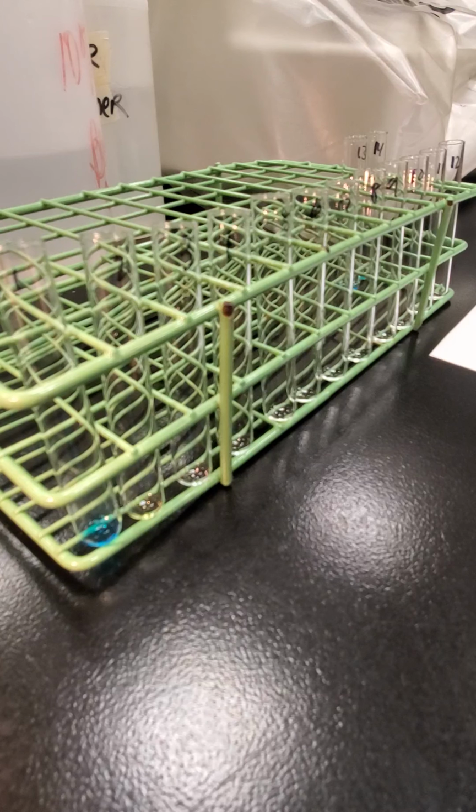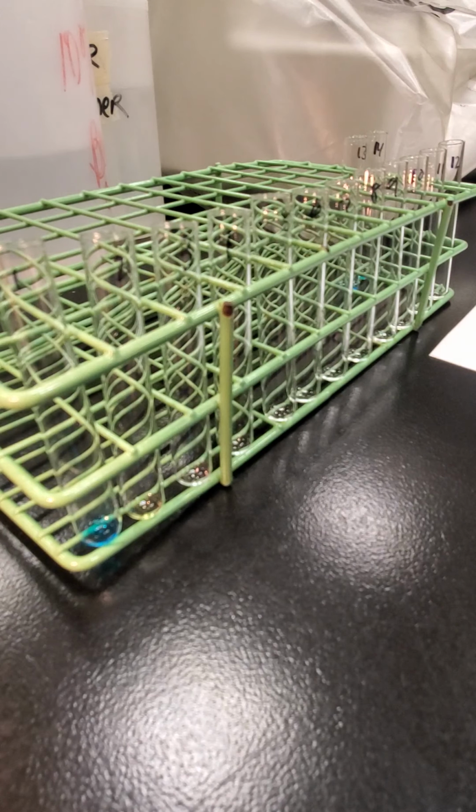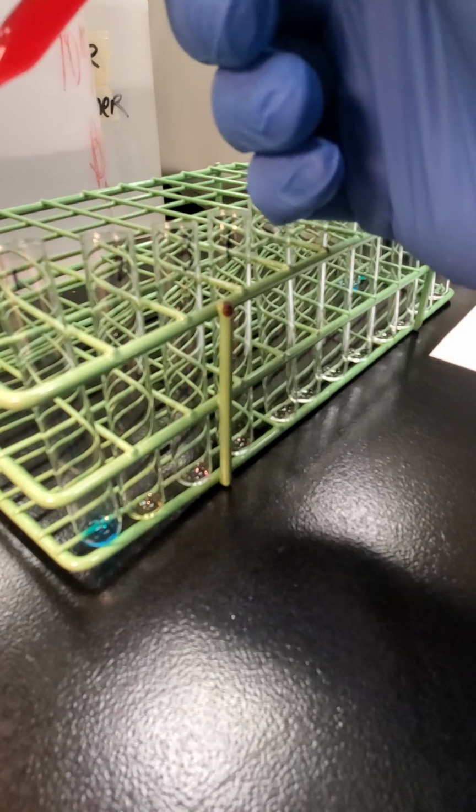Okay, so then now it says 1 drop of the reagent QC cells, so that's from our kit, to tubes 1 through 5. So again, that's for our ABO testing to make sure that our reagents are functioning the way they should.